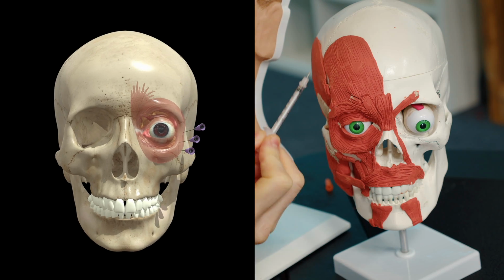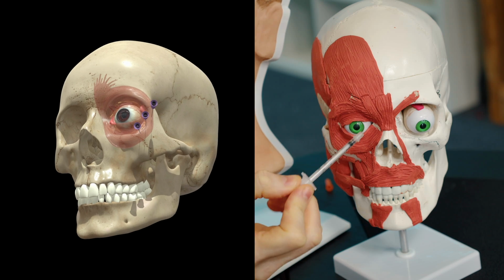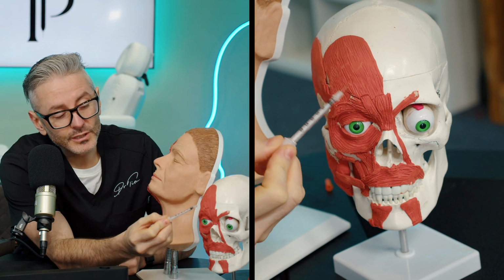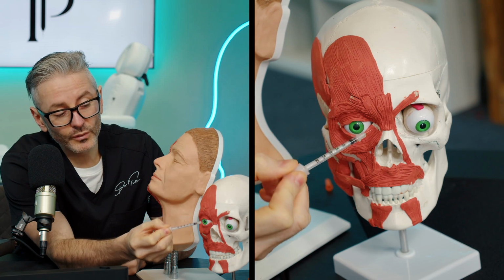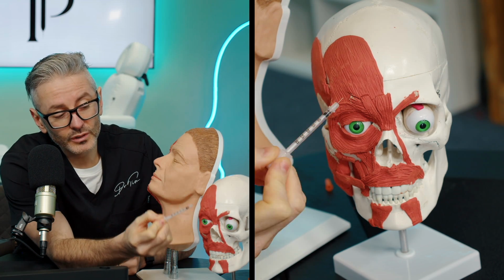Let's have a look at each area, and I'll explain why there are side effects, complications, and risks, as well as benefits of treating in each of these different areas of the face. This is the most common area that we are injecting when using botulinum toxins. So when you start to understand the big impacts that small movements in your needle make with the end result, you become a really wise injector.